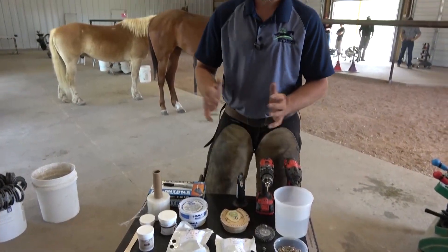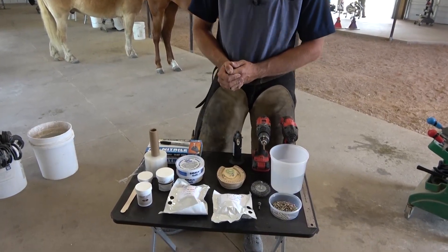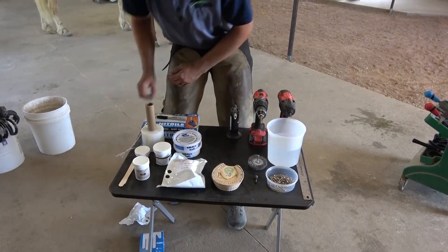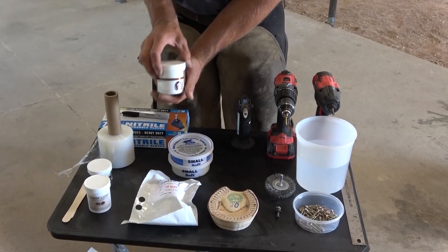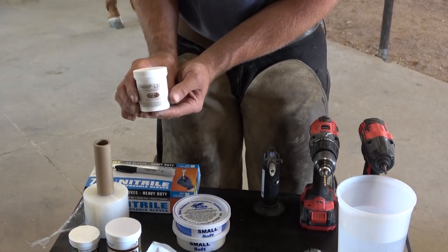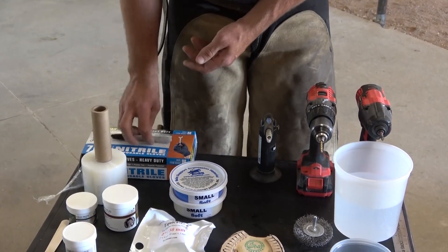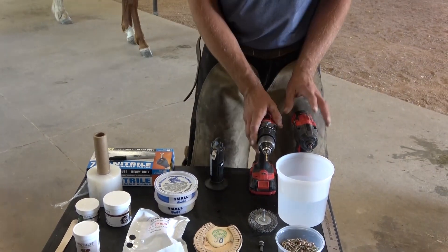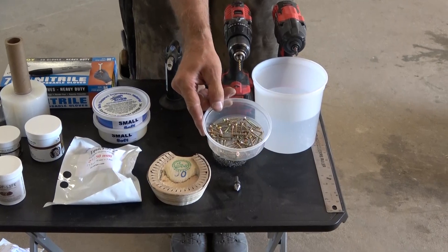One of the things that makes this successful is having all your prep work done before you start. So we've got two different types of casts today — a two inch and a three inch. We're going to use the two inch today. We're going to have our shoe already prepped and ready to go for our packing. We've got Soft Dim, we've got some Arty Mud. The glue we're going to use is Hoof Life — it's a methyl methacrylate glue and it works well with this type of casting material. Some stretch wrap, some gloves. If you're in a wet area you'll want a heat gun to dry out the foot and a moisture meter. A drill and an impact gun, a wire wheel, a countersink bit, and today we're using an inch and a quarter screw.